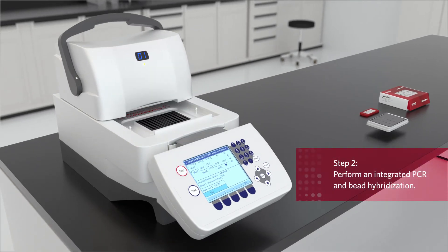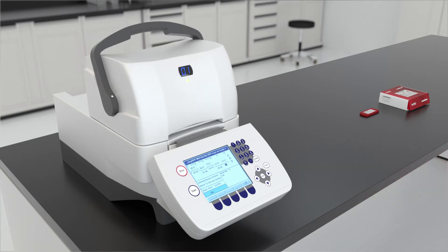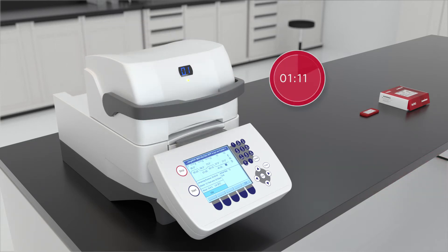Step 2. Place the sealed plate on the thermal cycler and perform an integrated PCR and bead hybridization on the samples.